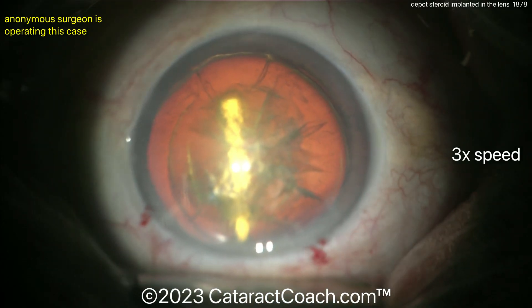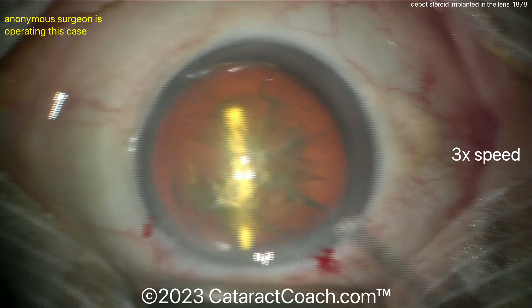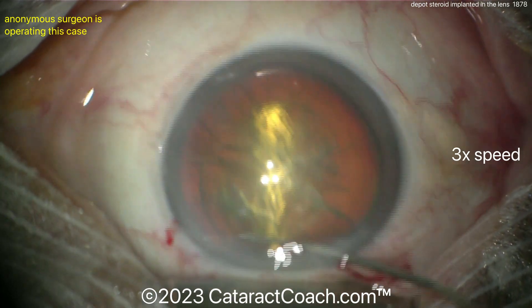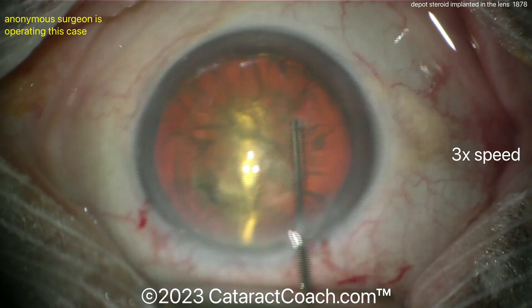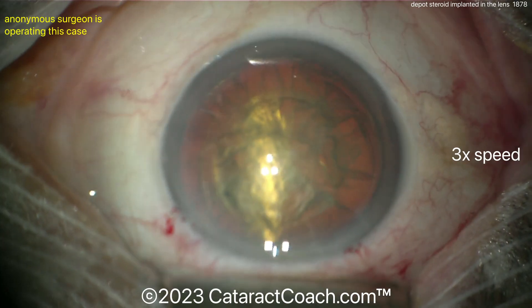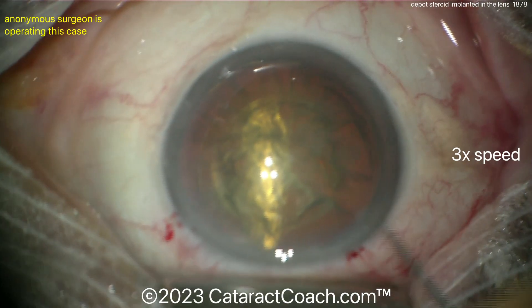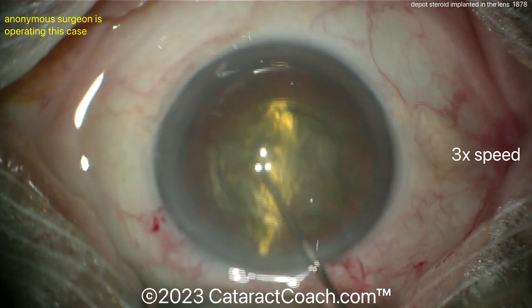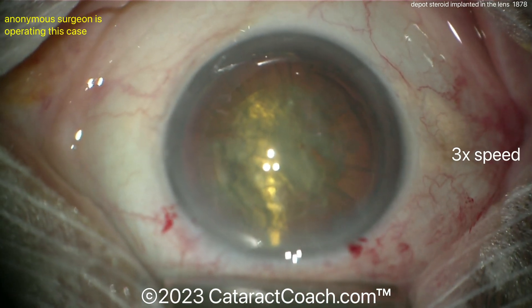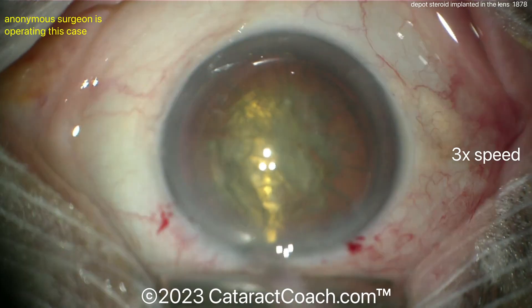Now doing a little hydrodissection. The bag is certainly compromised — the question is where, how extensively, and what are you going to do about it. I like this visco-dissection idea; that's a really smart move. I'd be very cautious about hydrodissection, and using a chopper or hook to loosen things up is a good idea too.